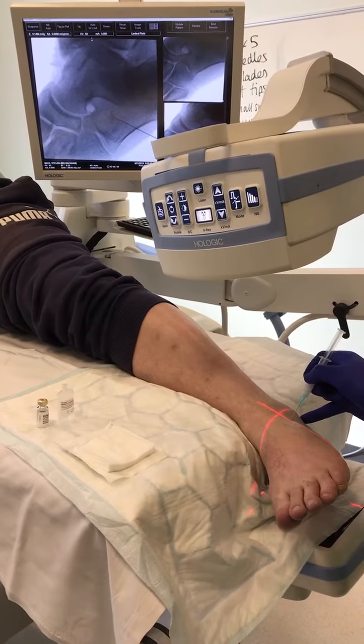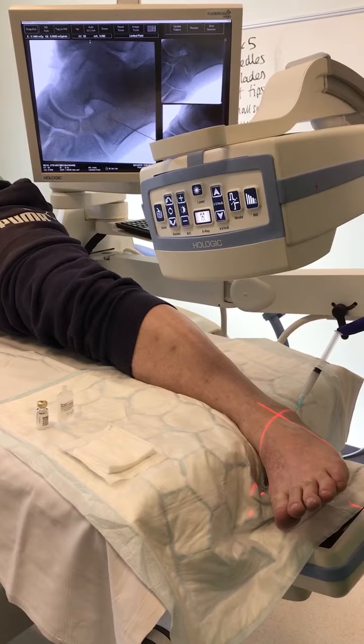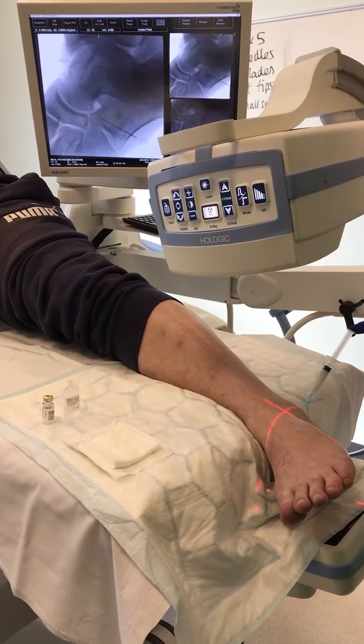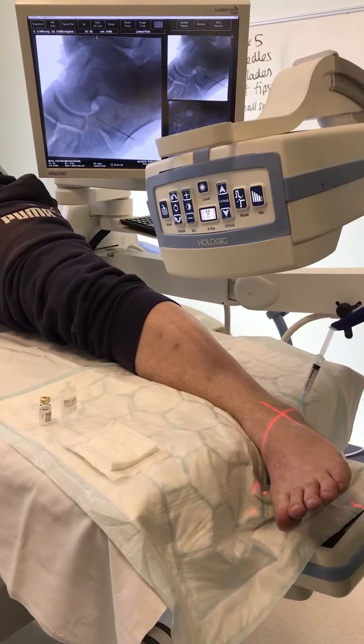Three, two, one, scratch. I'll do a little check. So we're quite close — just a little bit proximal and a little bit lateral. I'm just going to come across a little bit. Check again.